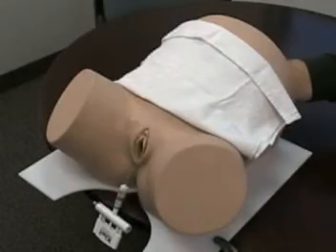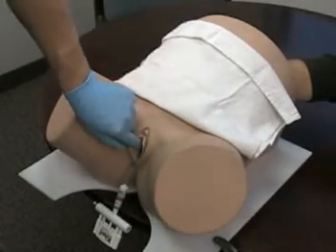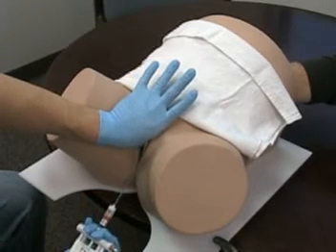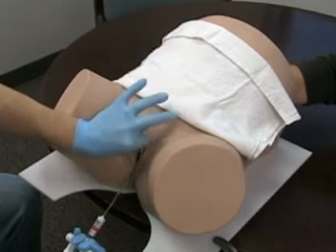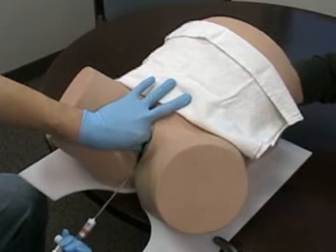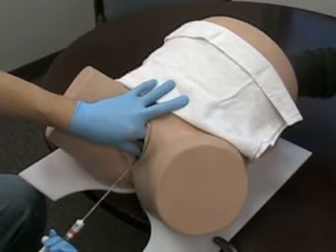Step 3 is exerting proper traction or drawing out of the fetal head in line with the axis of the pelvis. After vacuum is obtained, begin to exert traction on the fetal head in the direction of the maternal pelvis. Be sure to maintain pressure against the vacuum cup so as to prevent any sort of sudden detachment or pop-off.